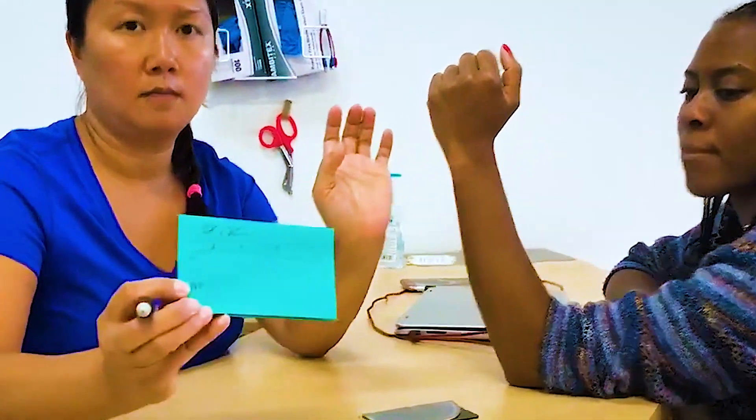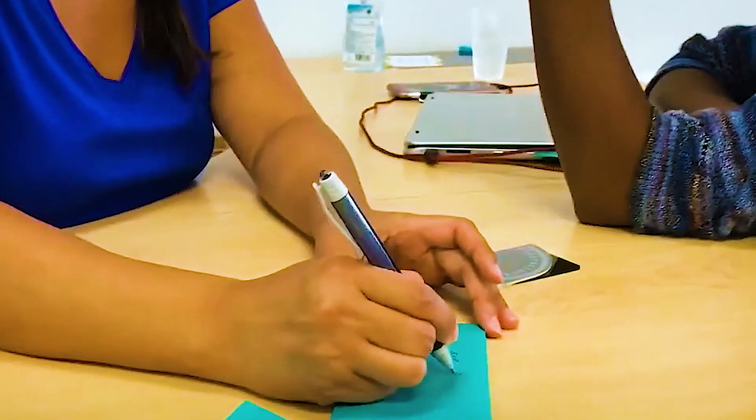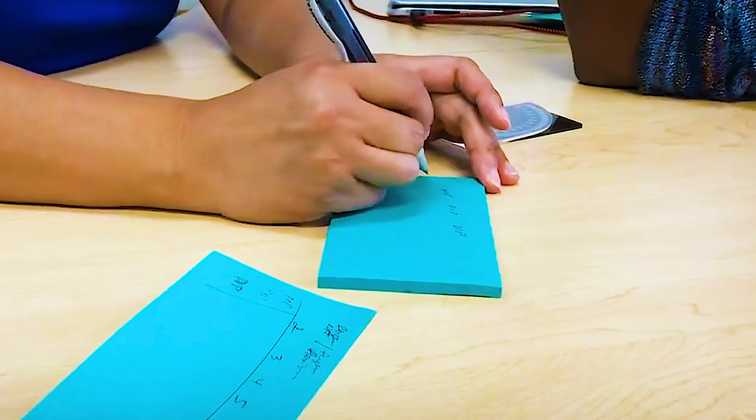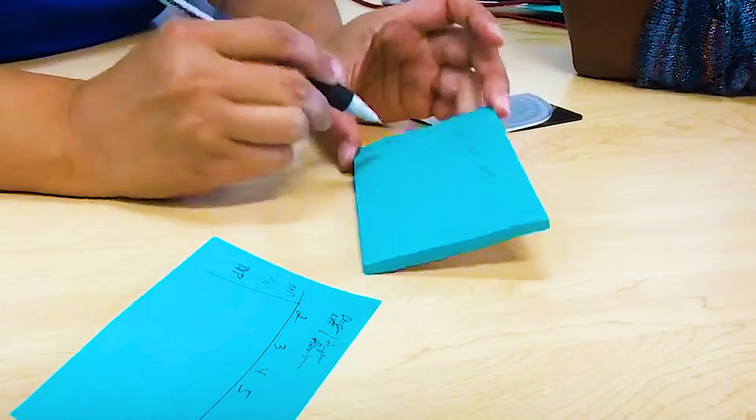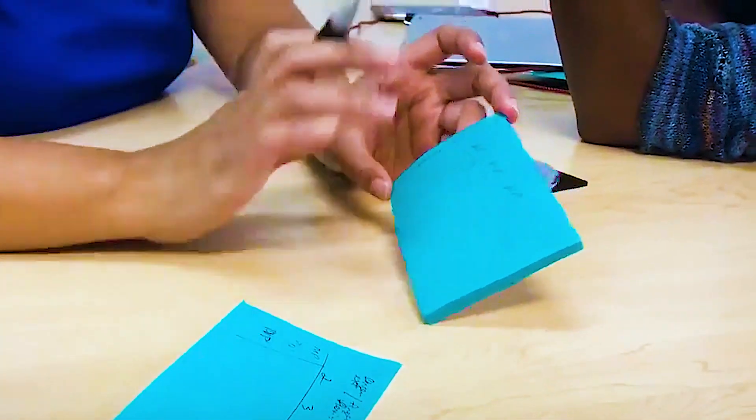You can create your own grid. You can do it like this — MP, PIP, DIP — and then second, third, fourth, and fifth fingers. However you do your grid, you always do the slash.